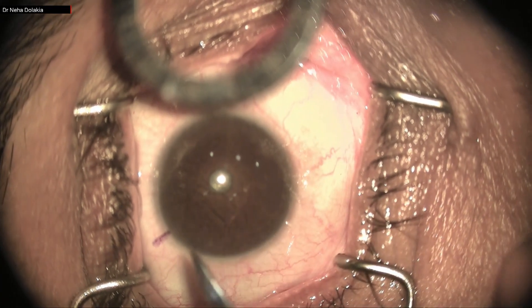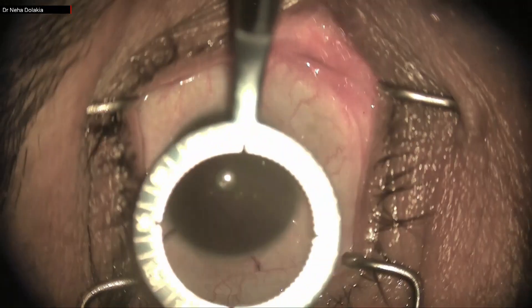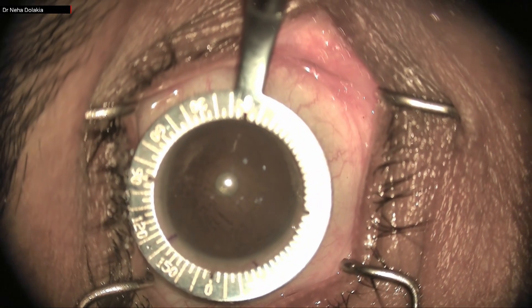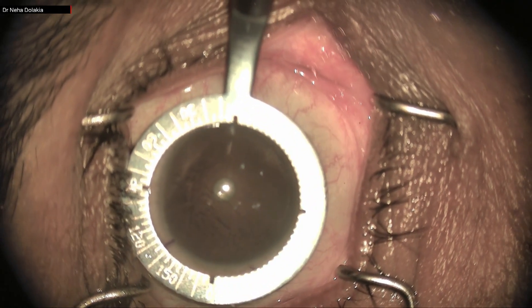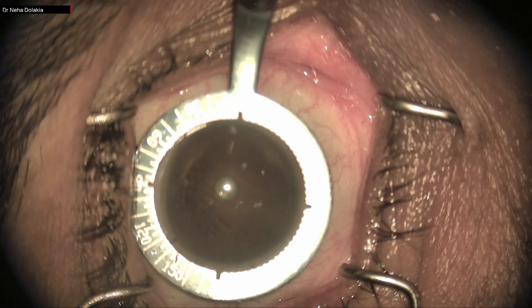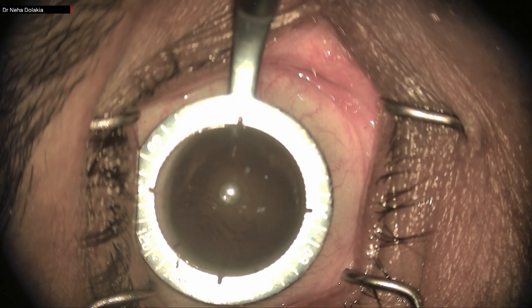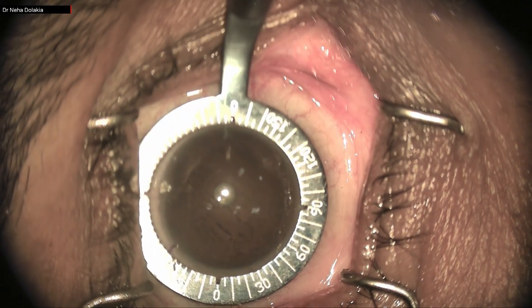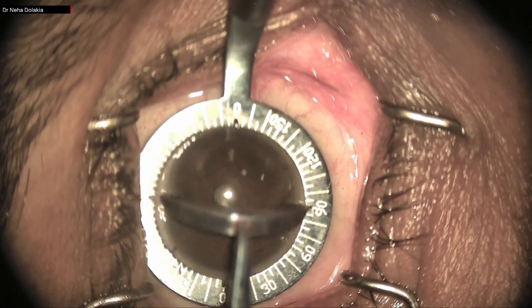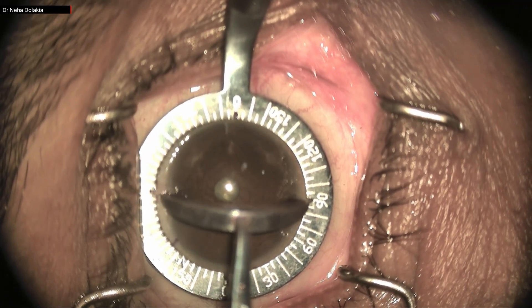I am marking the blood vessels radially so that I get a little marking on the cornea or at the limbus. The superior mark to the left is 127 degrees; the infero-temporal mark to the right is 27 degrees. I place the Mendes ring on it, align it, and now I can do whatever marking I want — say I have to place my axis at 90 degrees, and I've got my marking.